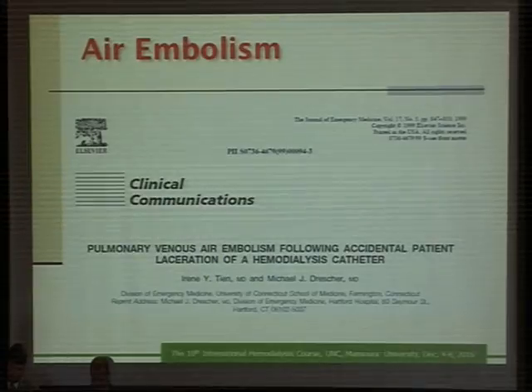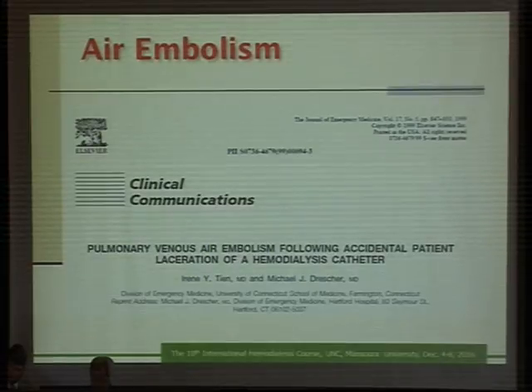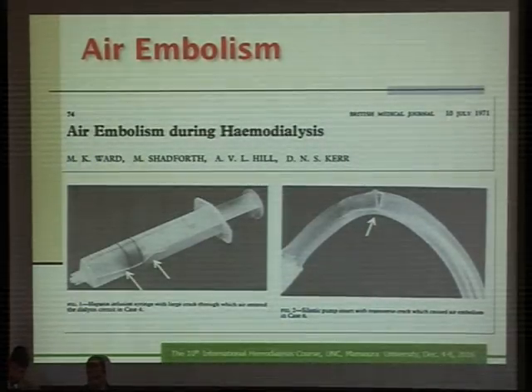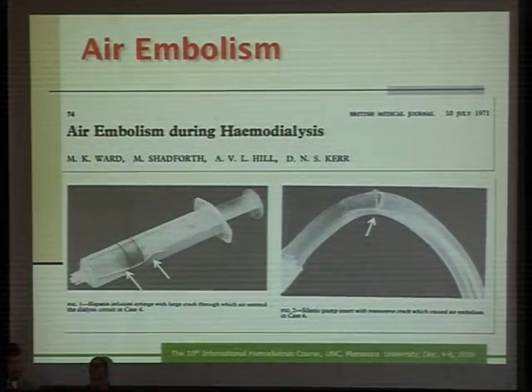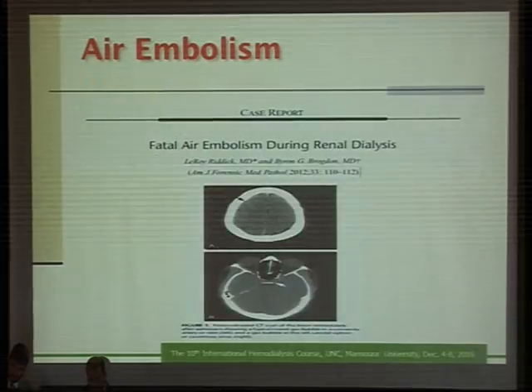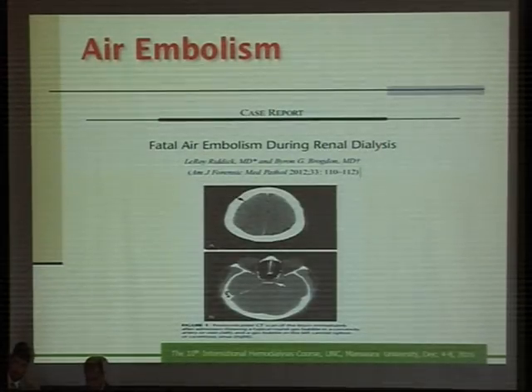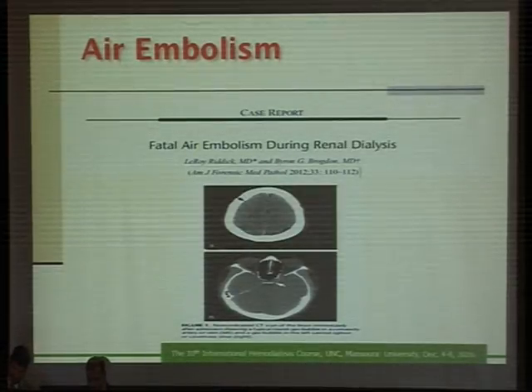These are some examples of what's reported in the literature: pulmonary venous embolism, air embolism following accidental patient laceration of the catheter, and non-contrast CT of the cerebral vessels.